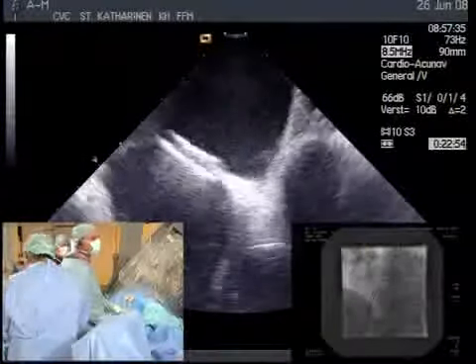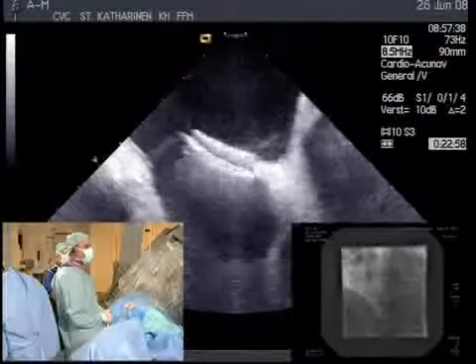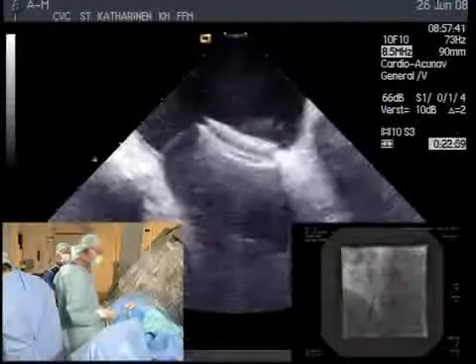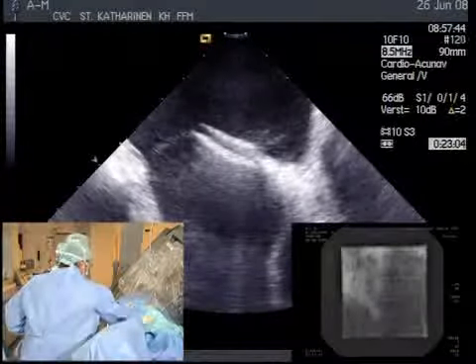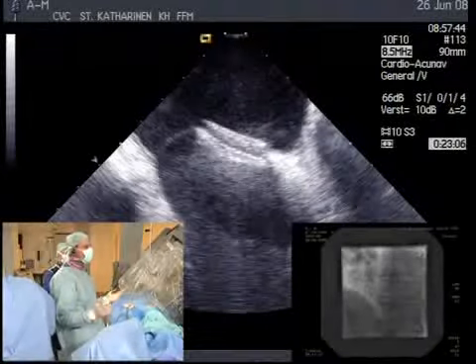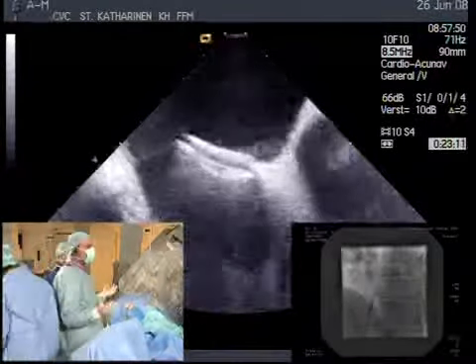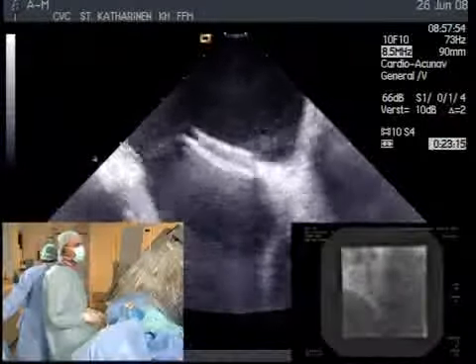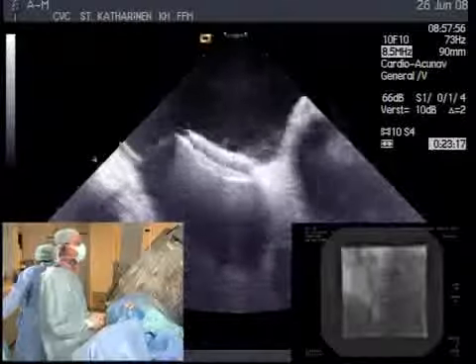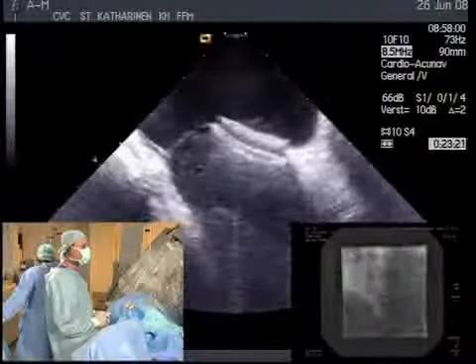In a patient with absent aortic rim or other rim, Ziad, would you still not do a wiggle? No, I don't do the wiggle at all. I rely mainly on echo images if I think that the device sits in good position. And you ascertain that by the echo and by fluoro. The wiggle does not really do me much at all, in terms of reassurance. The procedure is done. The patient will leave on aspirin and the Plavix.